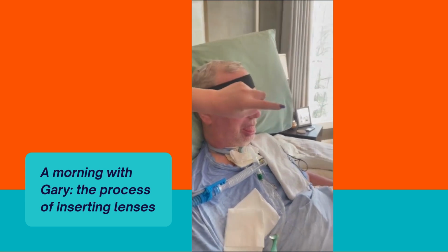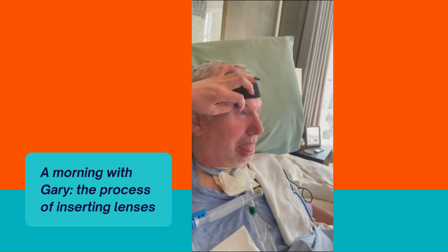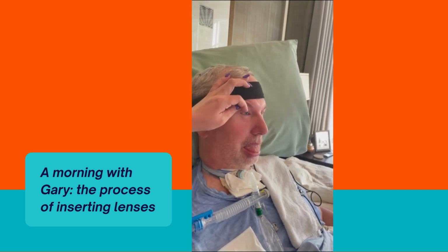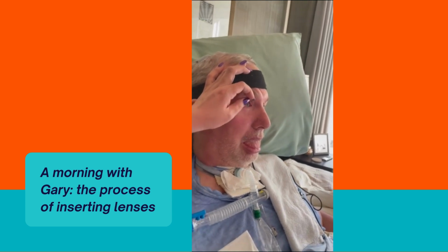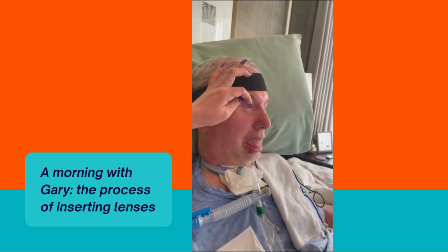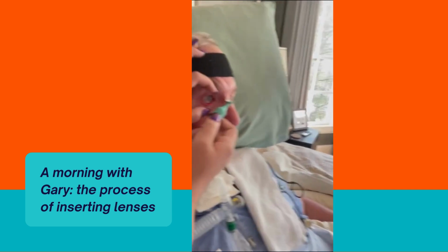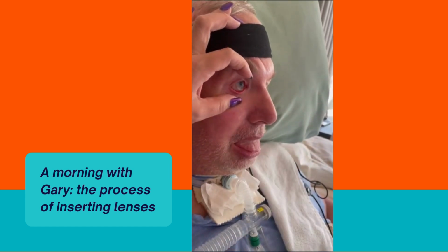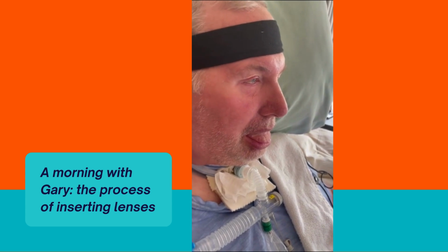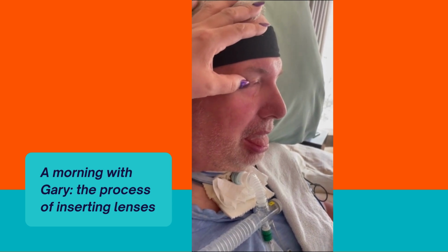We're going to take our pointer finger and we're going to crawl that eyelid up as high as possible. And then we're going to take 2 fingers to crawl it up. And then she's going to use her thumb to hold that. Crawls up all that. And then hold the bottom down. Now you're going to come up and you're going to rest your right hand on his cheek, and you're just going to flop it right on in. Nice, slow, and gentle. Give Gary time to adjust. We will help him blink a little bit.